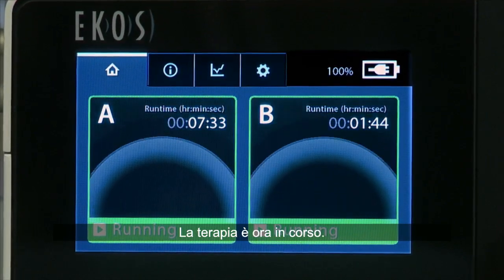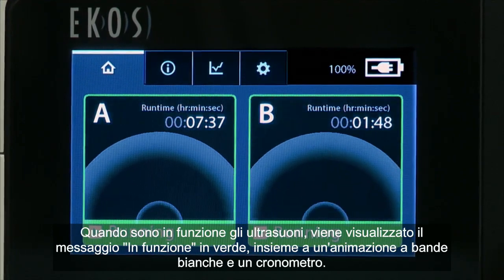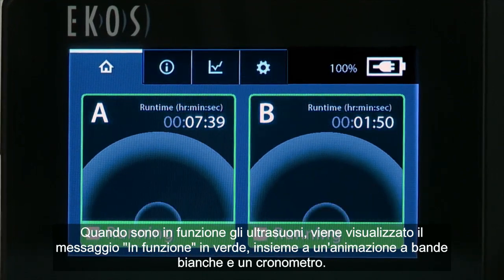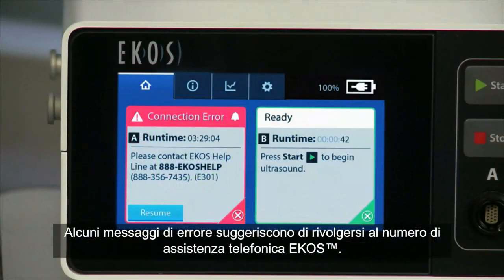Confirm therapy is running. When ultrasound is running, a green running indication is displayed, white bands animate, and a runtime clock counts up. Some error messages will prompt calling the EKOS helpline.